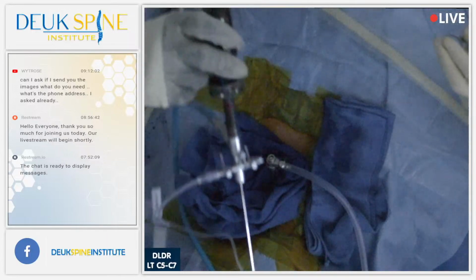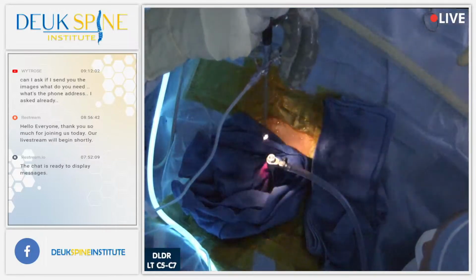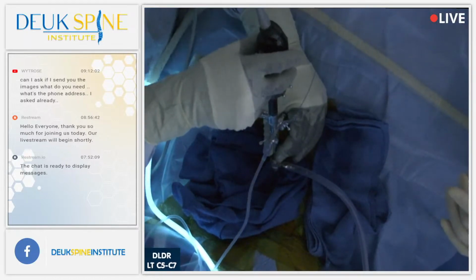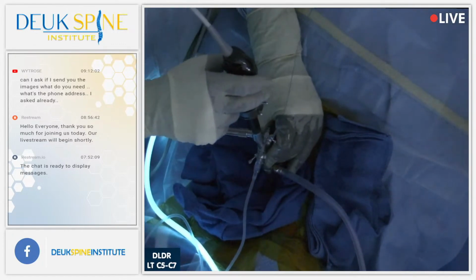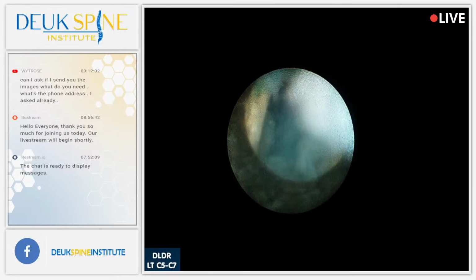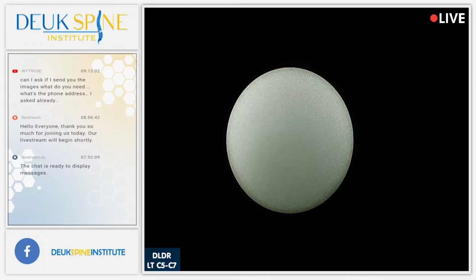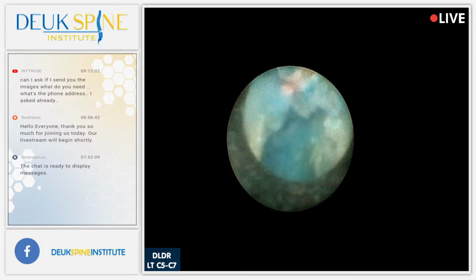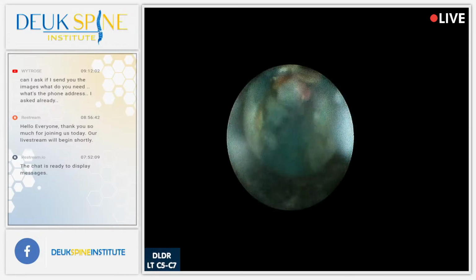Well, we just published our results at the Southern Neurosurgery Society meeting for the thoracic Deuk laser disc repair. And we've had a total of, I want to say, 15 patients. And 1 year after surgery, the average amount of thoracic pain relief was 99% of axial pain. Each of those are pieces of herniation there. The irrigation is nice and cold, folks. Nice job. The average amount of radicular symptom relief, thoracic radiculopathy, was 96%.